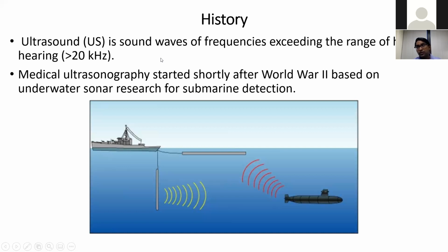So if we go below the hearing range, below 20 kilohertz, we can even see the use of sound waves in medical sciences, and that is basically the stethoscope. Stethoscopes use a very similar concept, in which we passively listen to the sounds coming from inside the body. The only difference is that the frequency range we are operating in is in the hertz range, somewhere between 50 and 2000 hertz. And that's the difference between a stethoscope and ultrasound-based imaging modalities. Ultrasound is more image-based. A stethoscope is only listening.